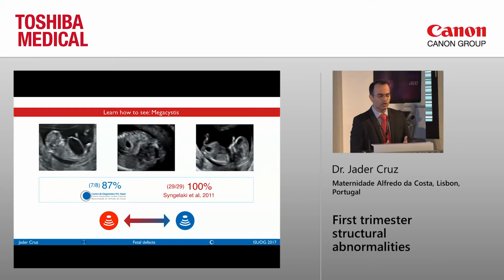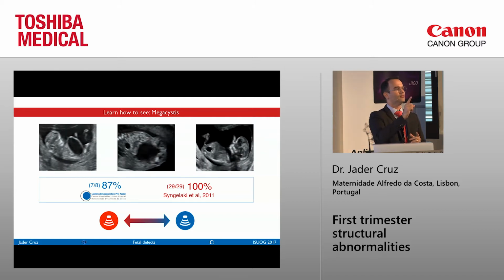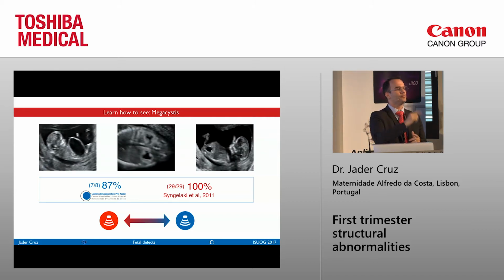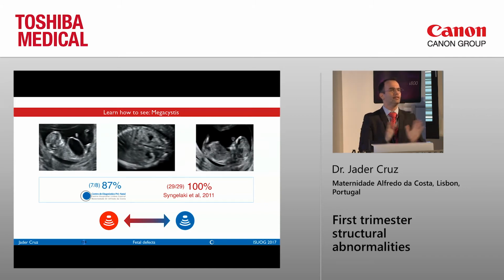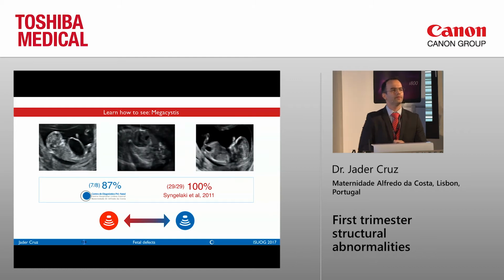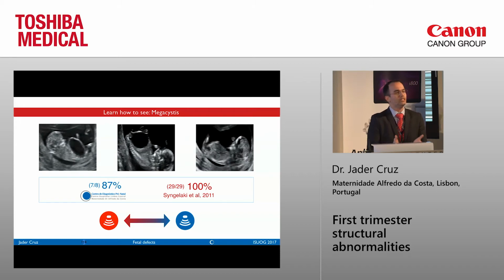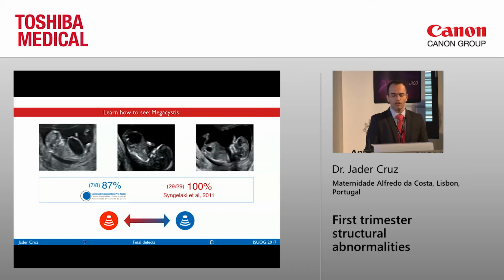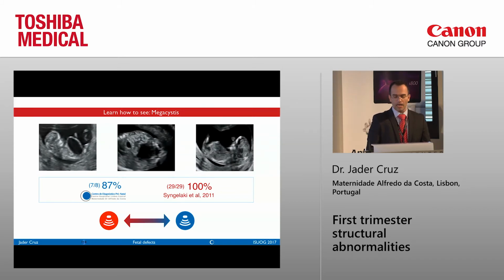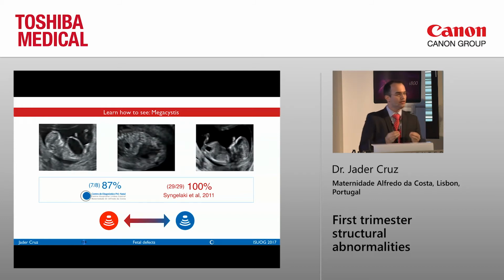So the person who looked at the baby, yes? Transabdominal. We do that, I mean, 98%, I will show you the data a little bit more. 98% of the time we do it transabdominally. And then by measuring that, you can actually detect better. So that's what happened. We were eyeballing that. Someone who did that thought it was a normal size bladder and didn't measure, so we missed this one. So that's important, learn how to see the abnormality.